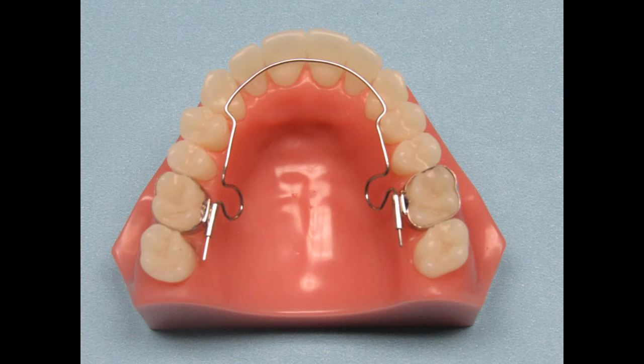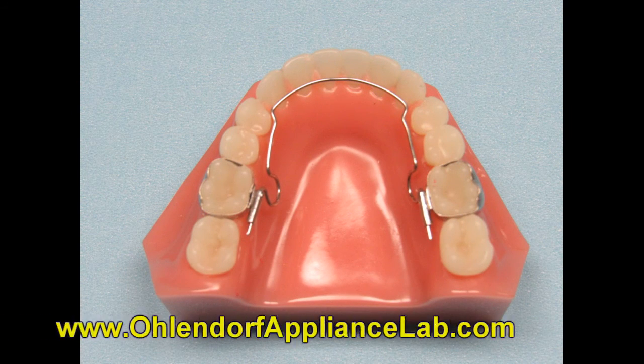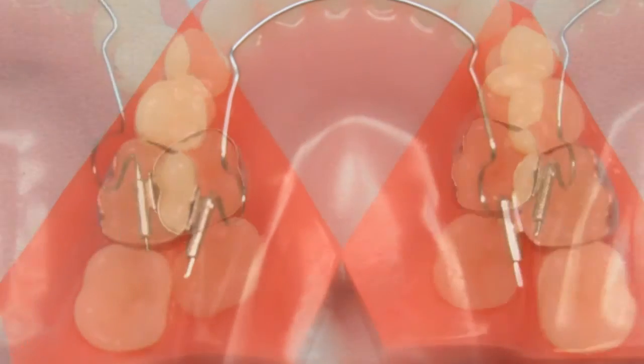When you receive the case back from us, you will receive the working model the appliance was made on and the completed appliance. The appliance will be totally passive and ready for you to insert and then activate. We recommend you insert the entire appliance as one unit, seating both bands with the appliance all at one time. We will include safety ties on the molar bands to make it easier for you to insert.